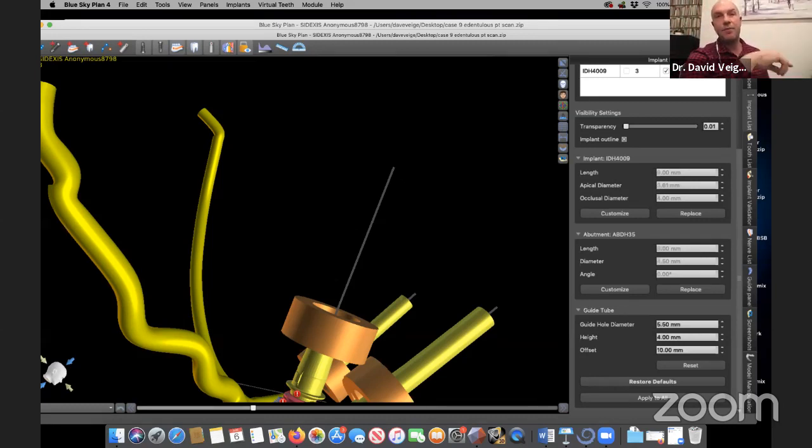And then I flipped over to using the Nextdent bleach shade temporary crown and bridge material. And what I do is I usually make that to full contour, and then I cut back the gingival area and add on material like Nexico or Gradia gum or something like that to give the gingival portion. Okay.